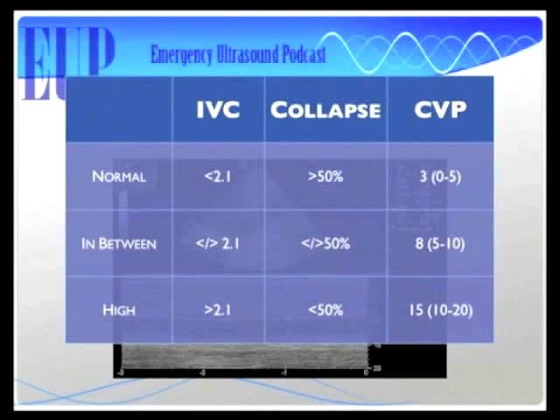Okay. All right. So this is how you can use IVC to get an estimate for whether volume is going to help your patient or not.